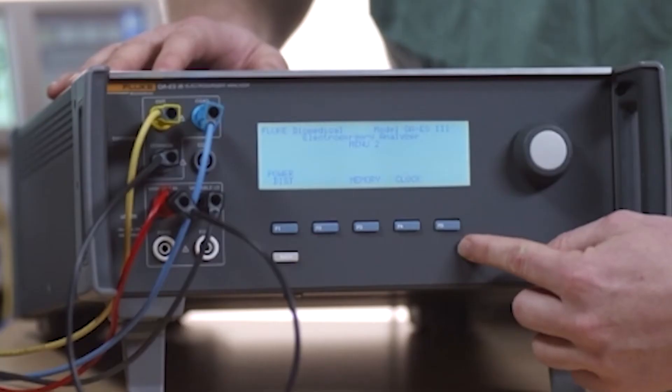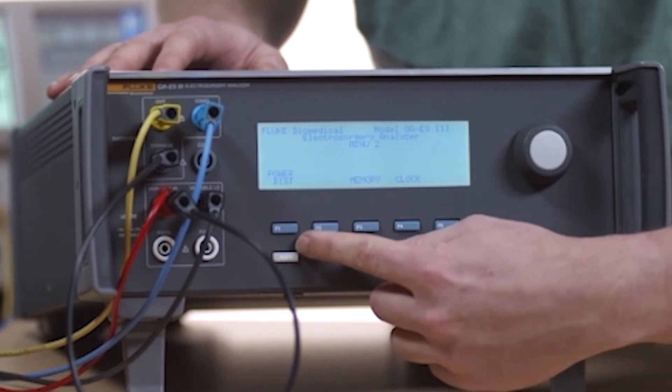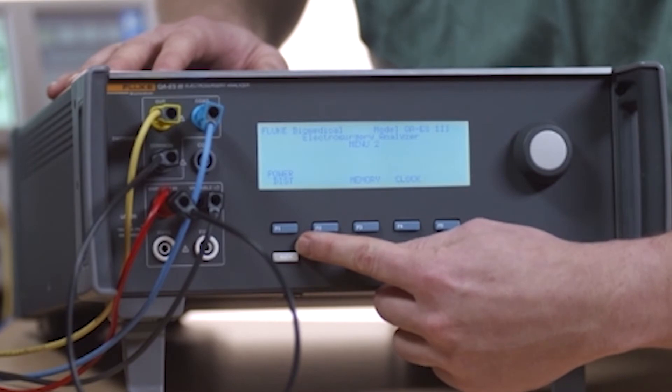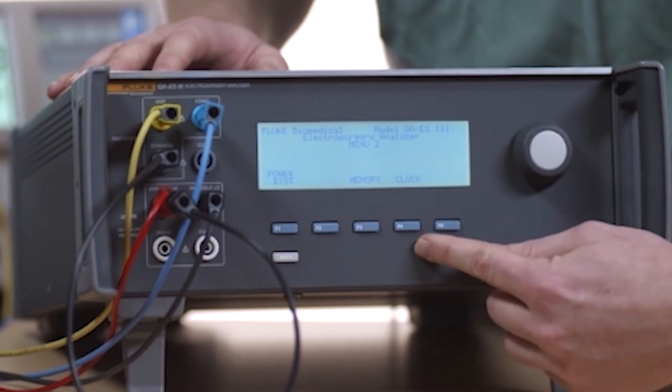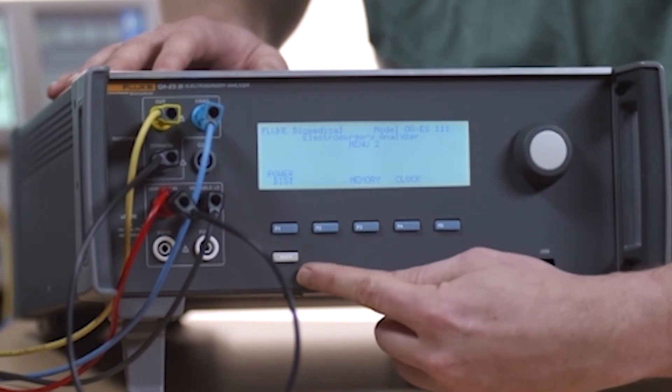From this menu, you can test power distribution, which is useful for evaluating the performance of the output guarantee functionality in some newer ESUs. This menu also lets you access the memory and set the clock. Use the back key to return to menu 1.